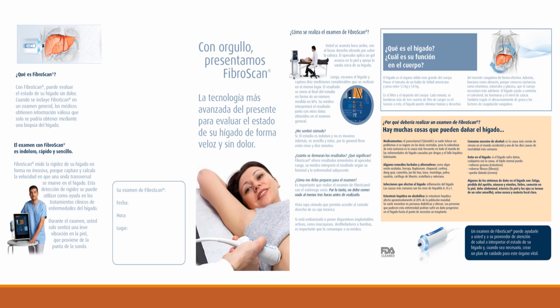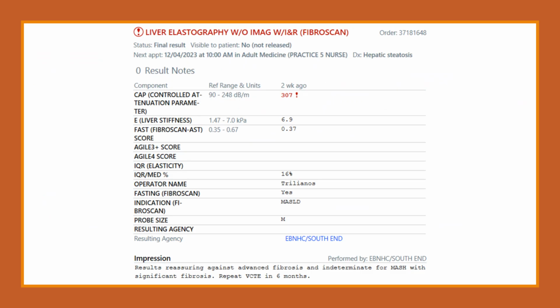A pamphlet like this is going to be shared with all practices in a PDF format. It can be used as an appointment reminder and for patient education. And again, reminding everyone that all patients should fast for 3 hours and wear loose-fitting clothes. The results will be sent to the referring provider within minutes of completion of the test, and my second pledge is to give you a clear-cut impression and recommendations for the next steps.